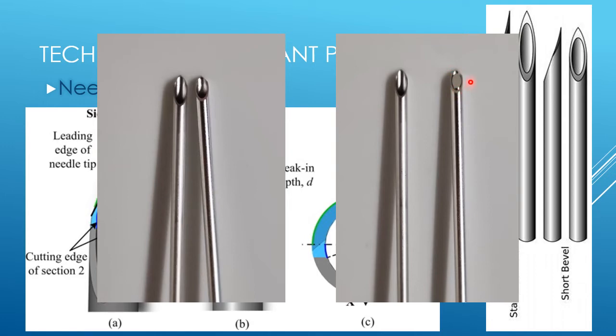if you're not able to control it as well, because in practical terms it isn't as sharp as the standard needle. So there is a definite learning curve to a pericardiocentesis needle, and I would generally recommend a standard needle unless you need the extra length that's given to you by the pericardiocentesis needle, and sometimes you do need that, so you need to have an understanding of the differences.